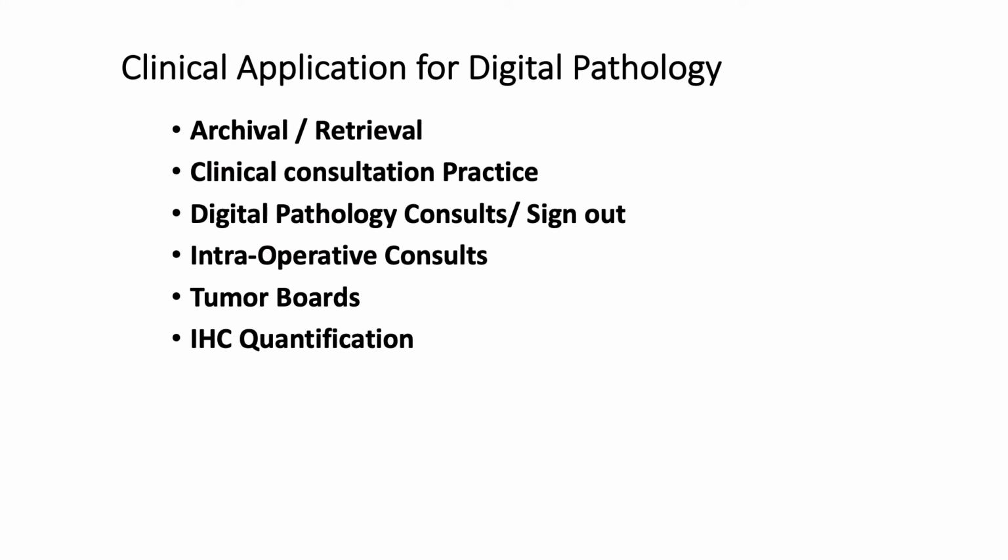The main applications of digital pathology have an important role in archival and retrieval of glass slides, clinical consultation practice, digital pathology consults, intraoperative consults, tumor boards, and immunohistochemistry quantification.